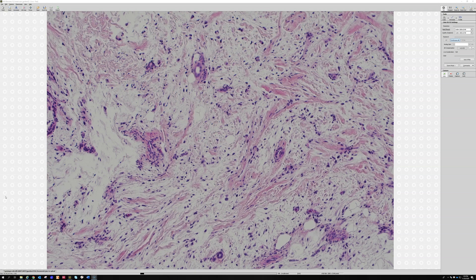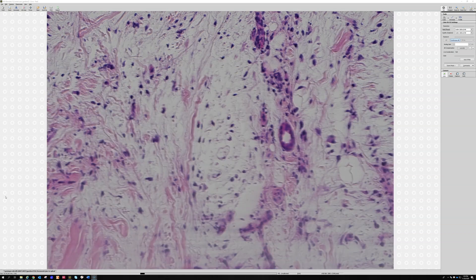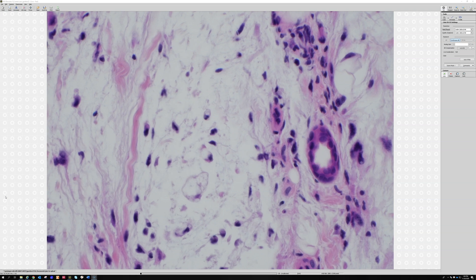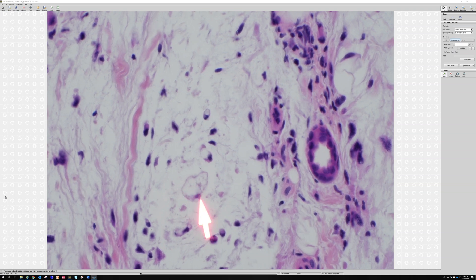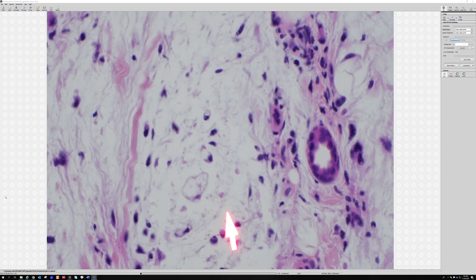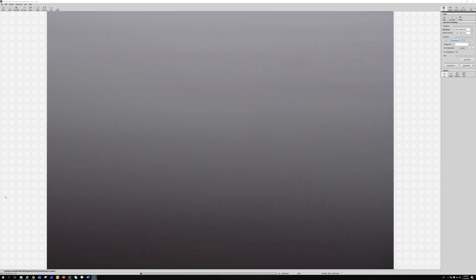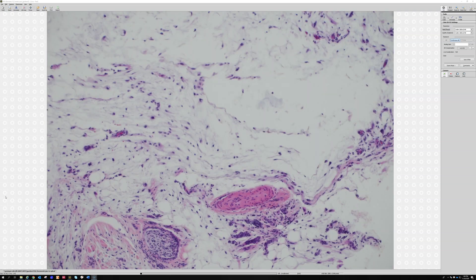Just the scattered pleomorphism in the myxoid background — and one other thing to point out: they have these bubbly cells. These are pseudolipoblasts. They have vacuoles, but the vacuoles are not like the nice sharp circumscribed ones we saw in true pleomorphic lipoblasts. It's got a little bluish color in the middle rather than clear or white space — the same color as the background — because this is a tumor cell that has sucked up the hyaluronic acid myxoid background. Here's another one over here, and another one down here. This is a common finding, particularly characteristic of myxofibrosarcoma.